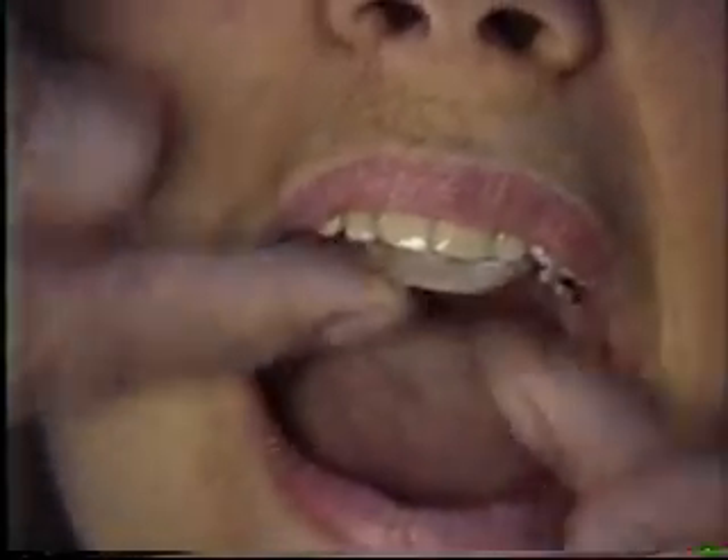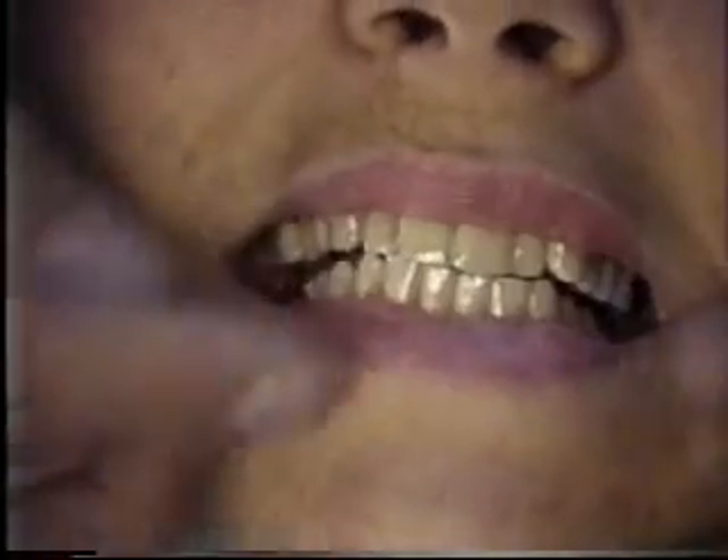This is an upper holly-type bite splint with an incline plane, which allows the jaw to go forward and brings it into a different position.